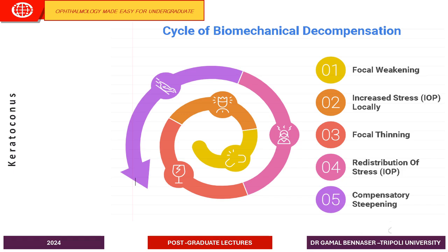Now, all patients suspected of being keratoconus or relatives of members of patients with ectatic disease should undergo the reverse order like this. We have to do the biomechanical assessment first, then we go for topography, and at the end you can find the finding in the slit lamp.